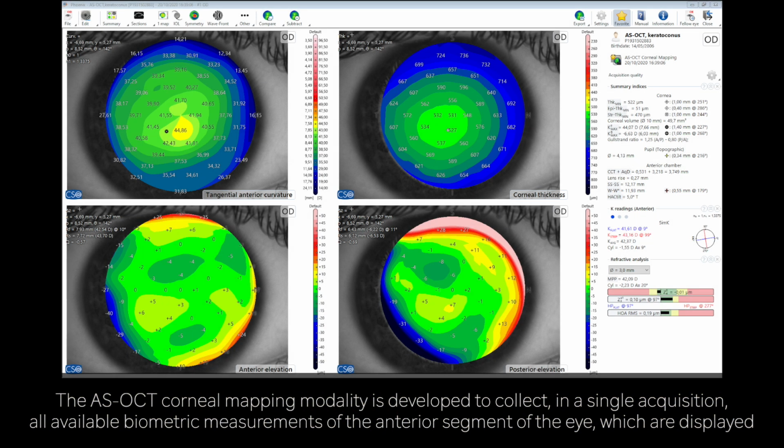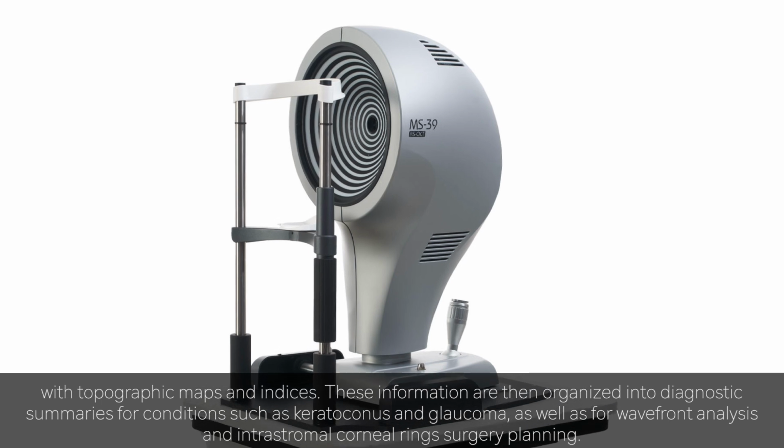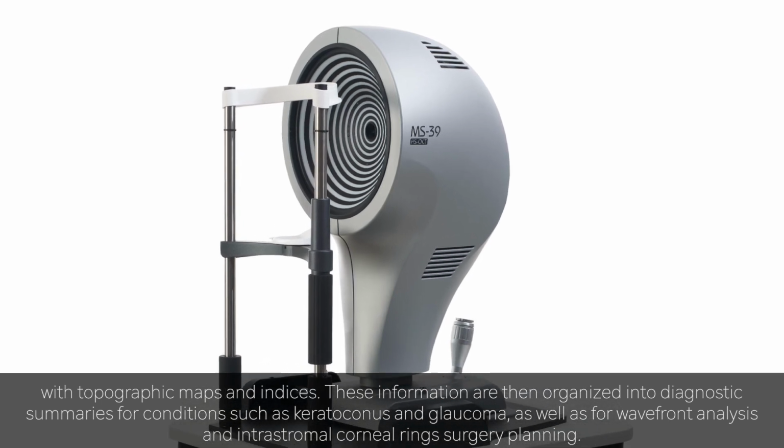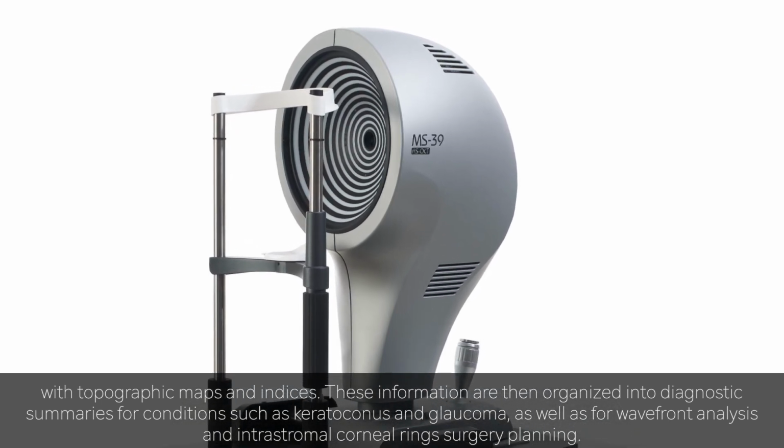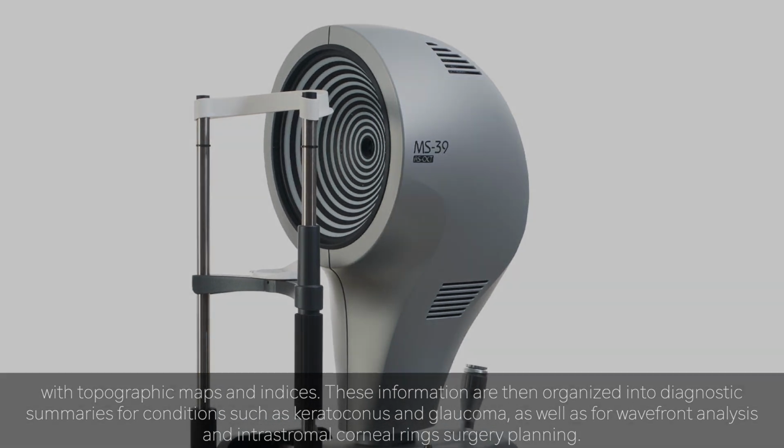The AS-OCT corneal mapping modality is developed to collect, in a single acquisition, all available biometric measurements of the anterior segment of the eye, which are displayed with topographic maps and indices. This information is then organized into diagnostic summaries for conditions such as keratoconus and glaucoma, as well as for wavefront analysis and intrastromal corneal ring surgery planning.